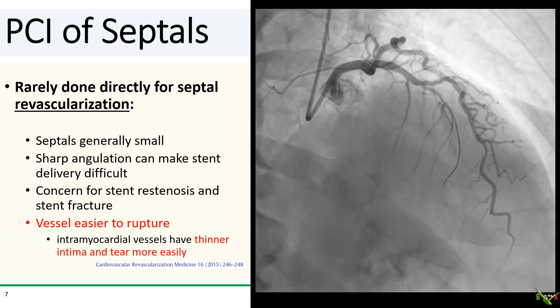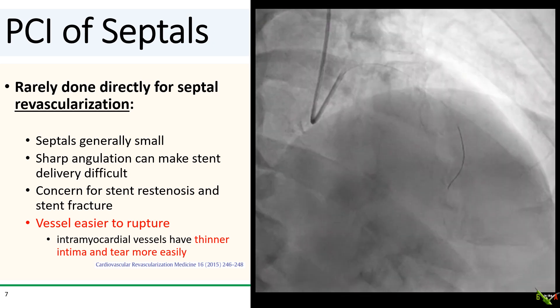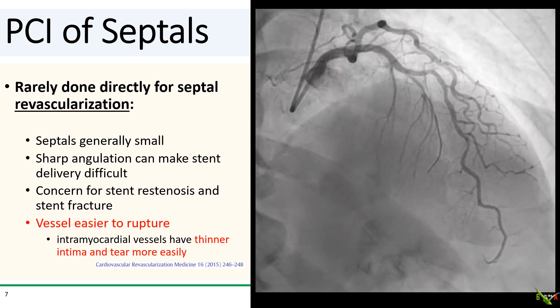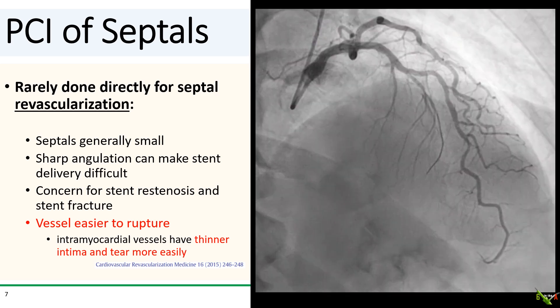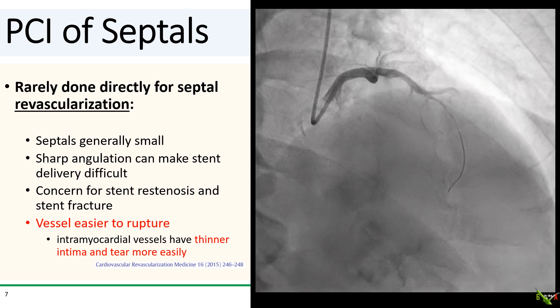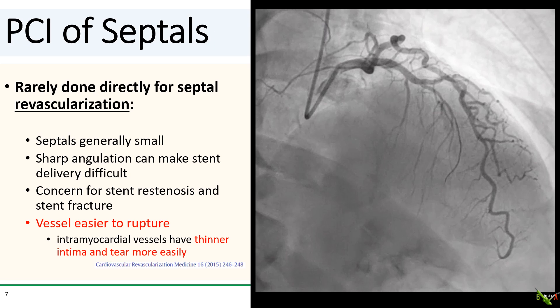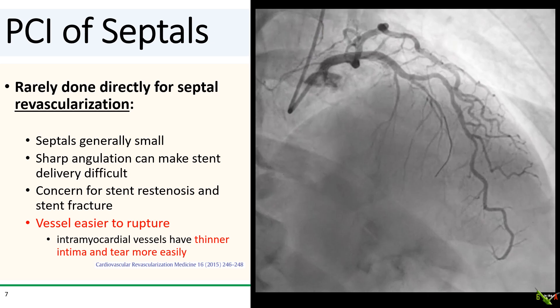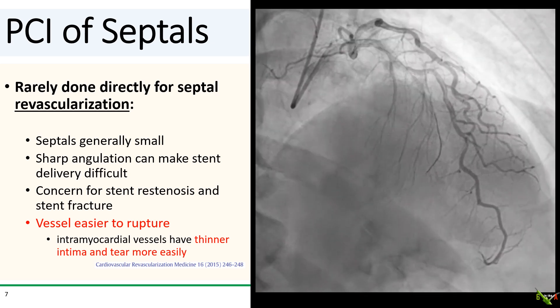Septal PCI for the sake of revascularizing the septal is rarely done, and for good reason. Septals are generally very small and typically arise at a sharp angle from the LAD, making passing stents difficult. Septals are also completely intramyocardial, so there is a higher risk of stent restenosis, especially near the edges, as well as stent fracture. Intramyocardial vessels are also easier to rupture, as they have a thinner intima and tend to tear more easily. Inflation pressures need to be kept low, and balloons and stents should not be oversized — this is true of myocardial bridges as well.